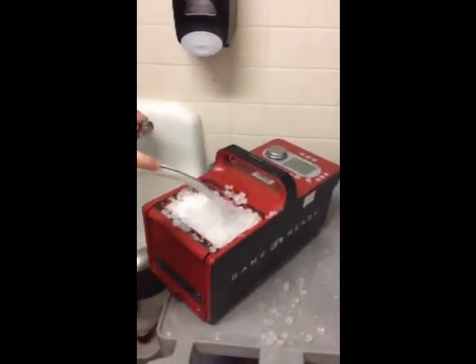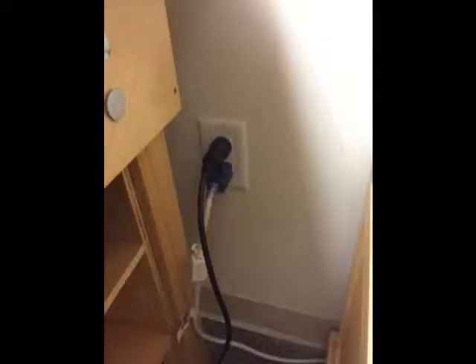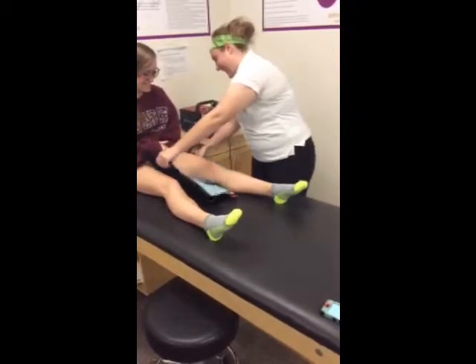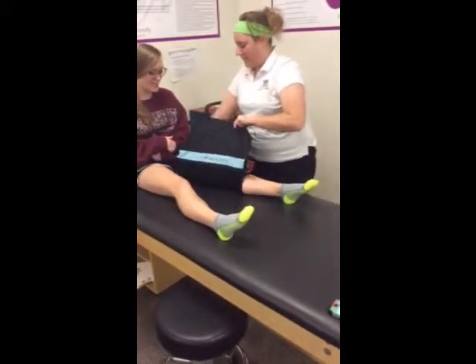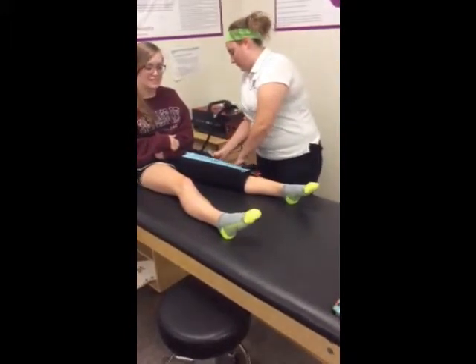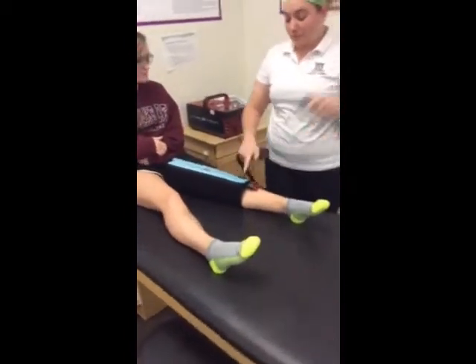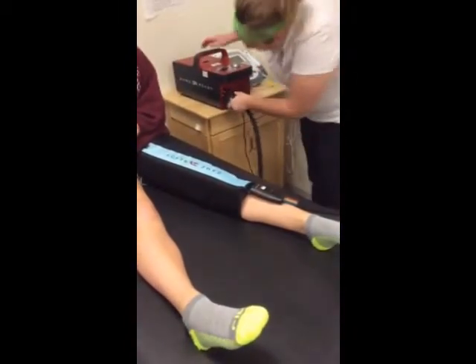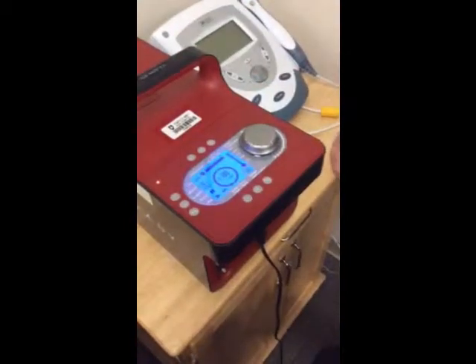Start by filling the cavity of the unit with ice and water, filling the cavity to full capacity. Then plug the power source into a grounded 3-prong wall outlet and plug the power cord into the front of the unit. After the cavity is filled and the lid is closed, apply the sleeve of the unit to the extremity and tighten it. Be sure the sleeve is snug but does not apply pressure to the limb. Next, attach the sleeve tube to the pump and be sure you hear it click. Press the power button on the unit and begin setting up the treatment.